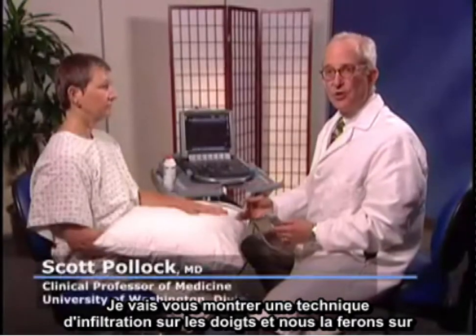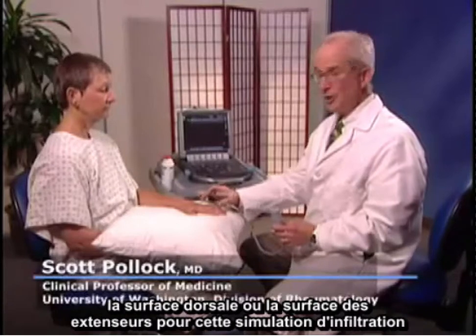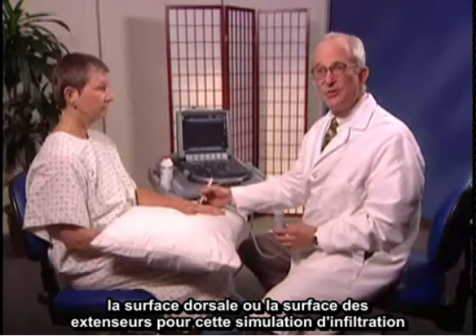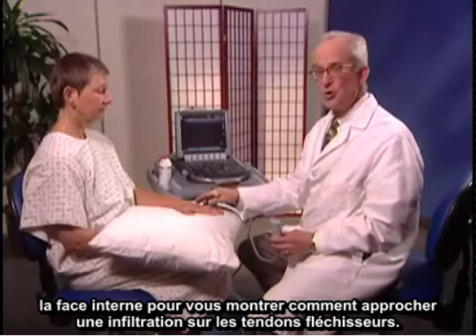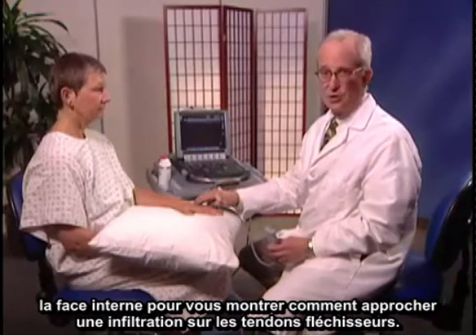I'm going to show a technique for injection of fingers. We'll do on the dorsal surface or extensor surface a simulation of injection of either a PIP or MCP joint, and then turn the hand around on the polymer surface and show you an injection approach for flexor tendons.